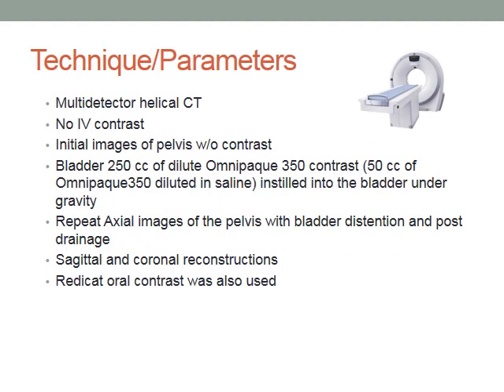The technique and parameters listed are what I found on the CT department page of our hospital website. Multi-detector helical CT is used. No IV contrast. The first image taken was an image of the pelvis without contrast.